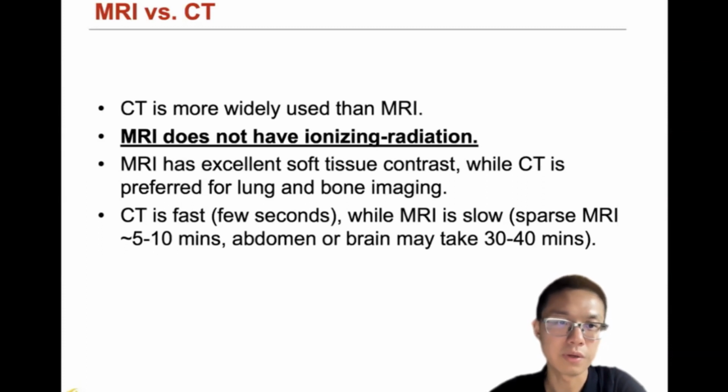So let's maybe do a comparison between MRI and CT. First of all, CT is more widely used than MRI, because for some diagnoses, CT is enough. You have enough resolution to do the diagnosis, especially if it involves dense structures like bones. CT is very good at imaging dense tissues like bones, very clear, and it's much easier and cheaper. So that's why CT is more widely used than MRI.